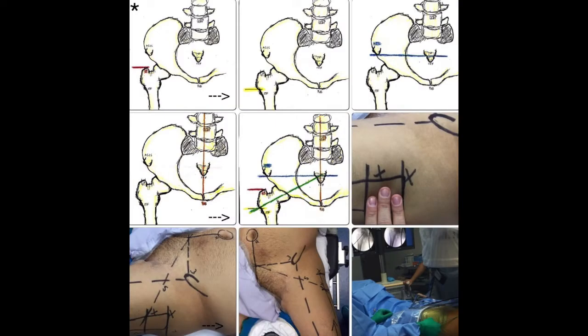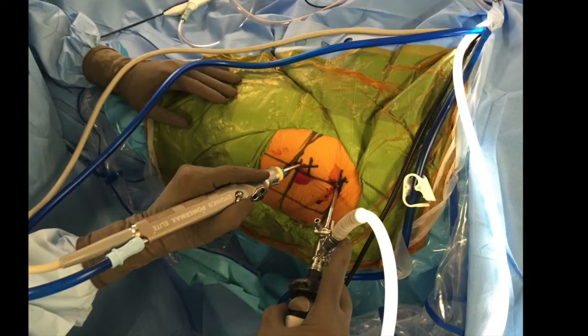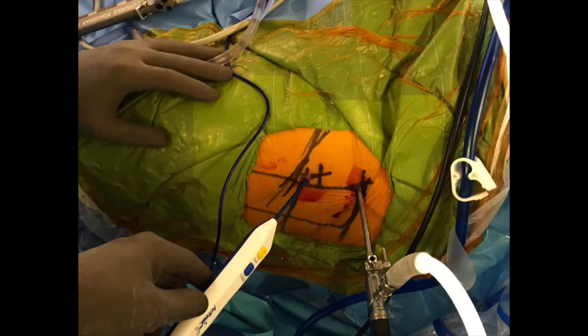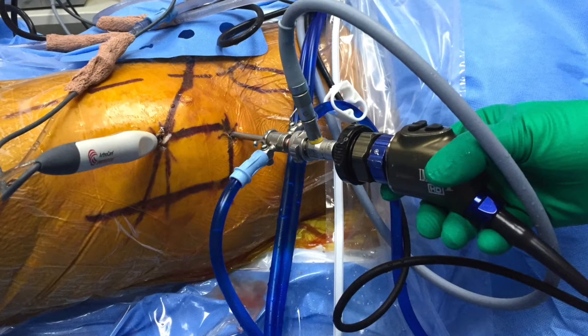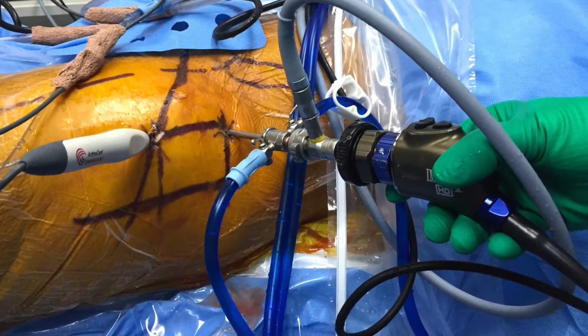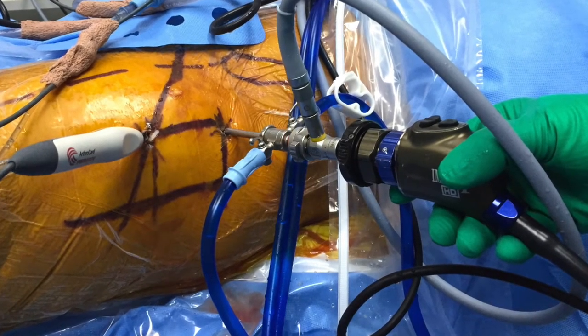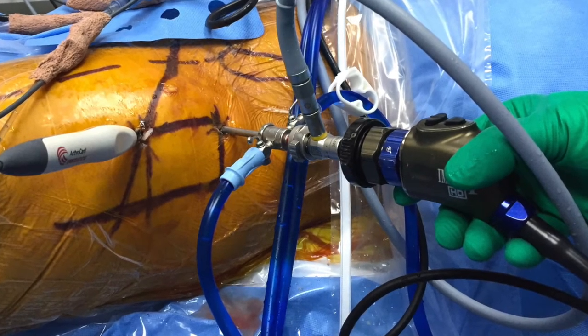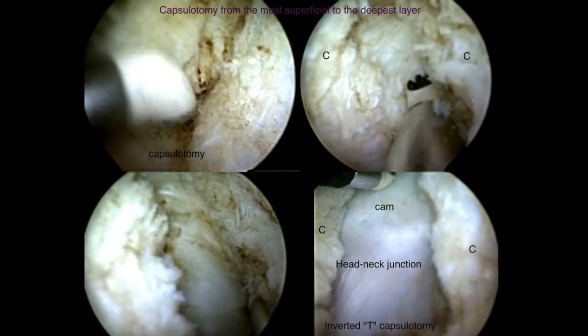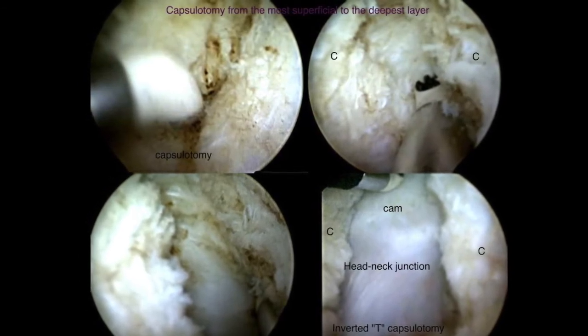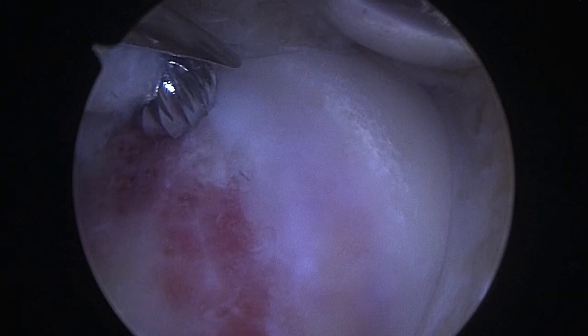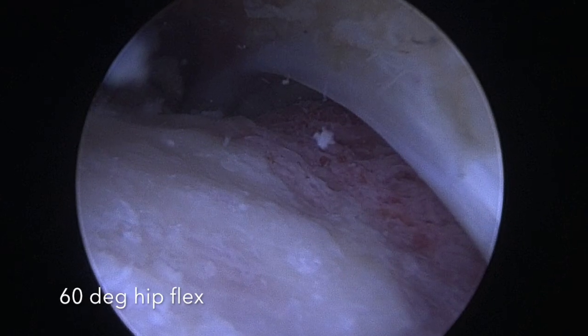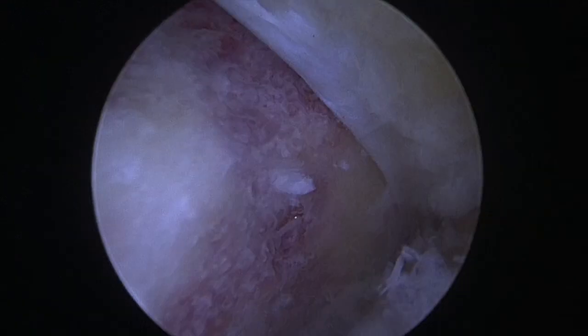Here you can observe the summary of preoperative steps. We use an anterolateral portal for vision, a peritrochanteric space or working portal, and sometimes a mid-anterior portal. We start working on the peripheral compartment to perform an inverted T or H capsulotomy, where we will observe the head-neck junction and the femoral head. Femoral osteochondroplasty is performed in a standard fashion. An arthroscopic dynamic impingement test is performed post-CAM decompression.